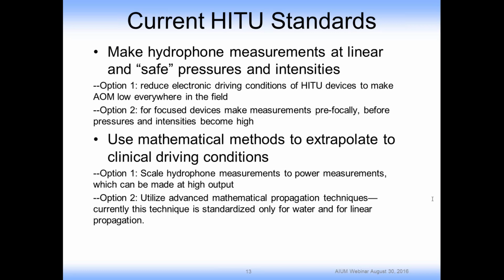The second option, where you made the prefocal measurements, can be supported by some advanced mathematical propagation techniques. It's essentially using techniques for solving partial differential equations to capture data that was taken in the prefocal plane and plug it into a partial differential equation type of solution that can predict what the pressure would be elsewhere in the field. And currently, this technique is standardized only for water and for linear propagation. That is, it does not include the nonlinearities that occur in water or potentially in tissue. But that is currently in the standards using these propagation techniques.